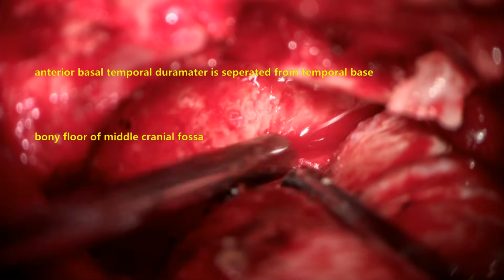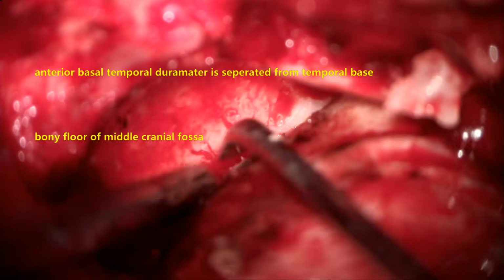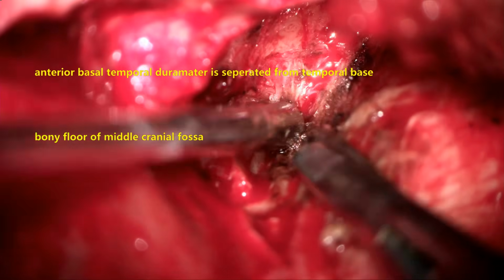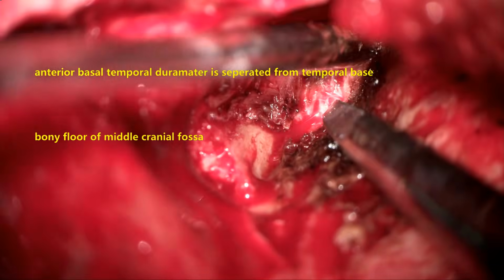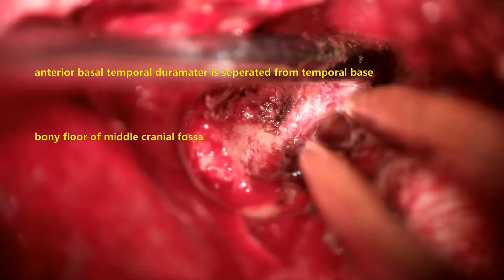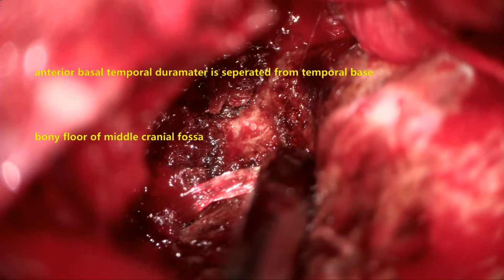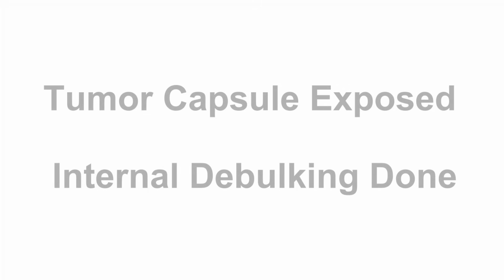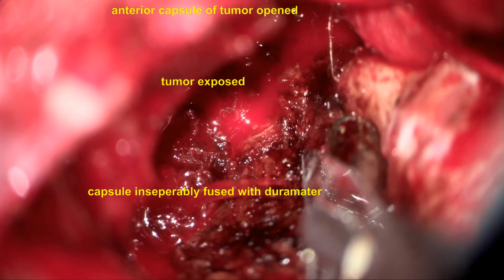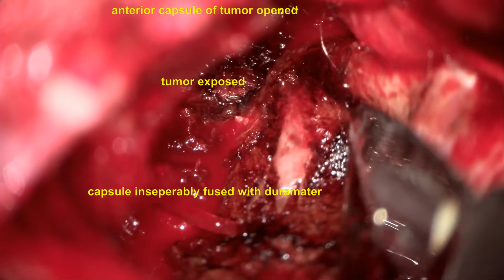There will be some bleeding from the bone of the temporal base, which we can stop with bone wax or monopolar cautery. The basal dura is separated, and we have reached the anterior and lateral wall of the cavernous sinus. Once that is done, we can feel the anterior part of the tumor with the suction and the instruments. At this juncture, we thought we would open the dura, the capsule of the tumor, and start the debulking.